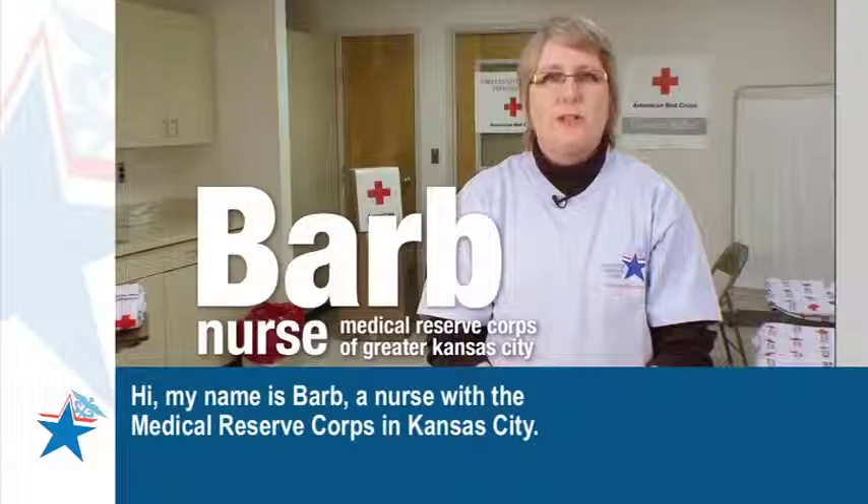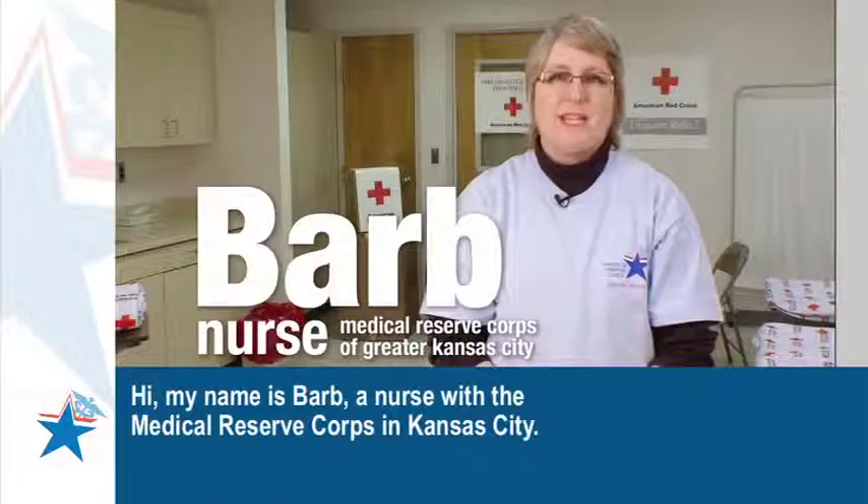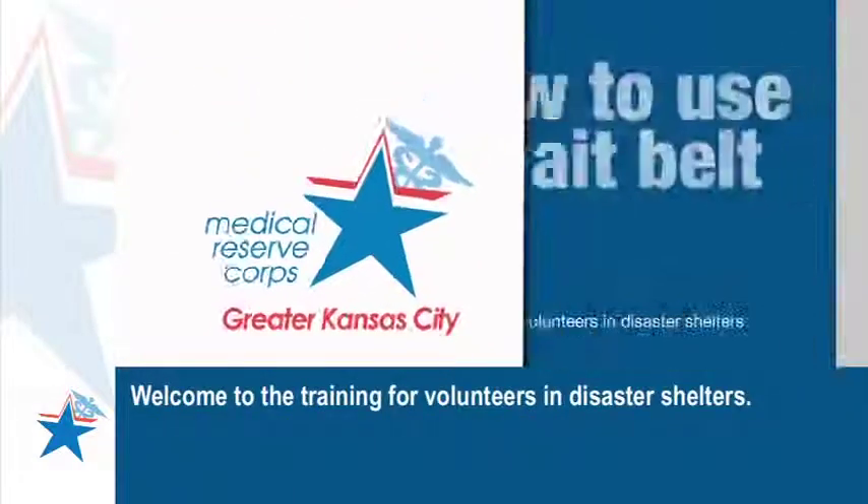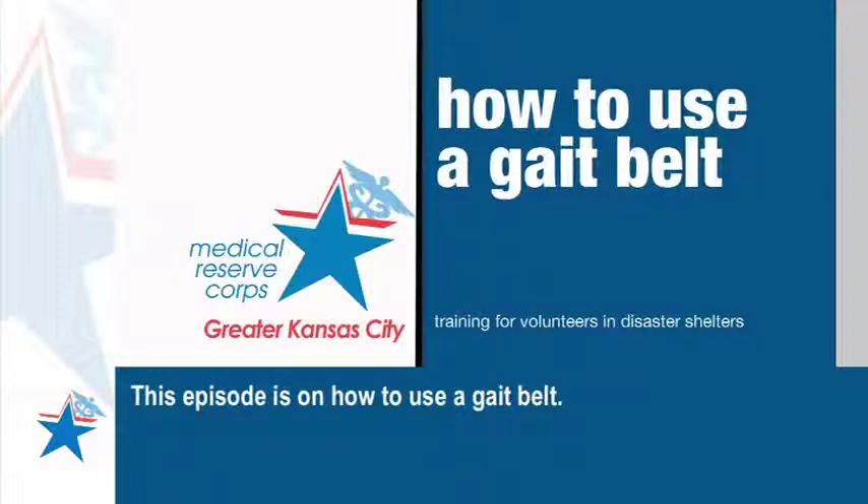Hi, my name is Barb, a nurse with the Medical Reserve Corps in Kansas City. Welcome to the training for volunteers in disaster shelters. This episode is on how to use a gait belt.